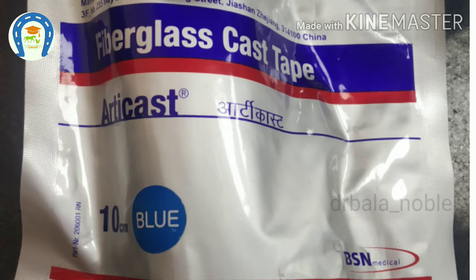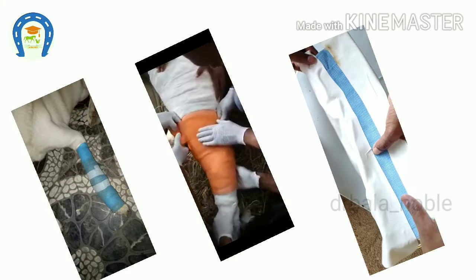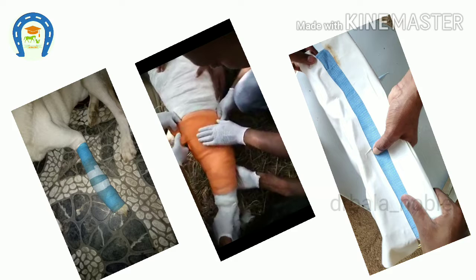What is fiberglass? Fiberglass is nothing but a synthetic plastic that can be shaped. This material can be applied as a cast or splint.